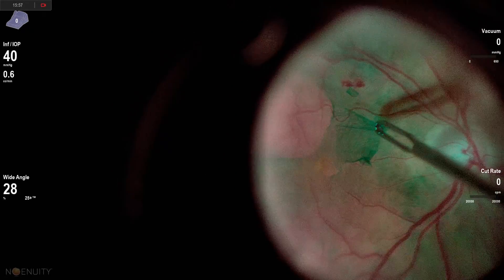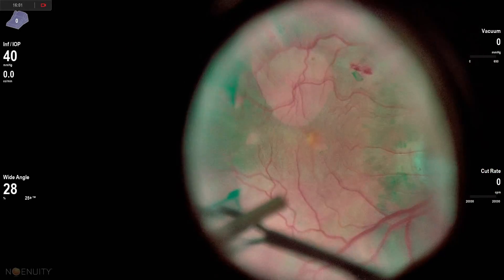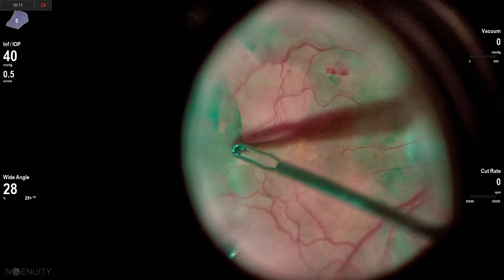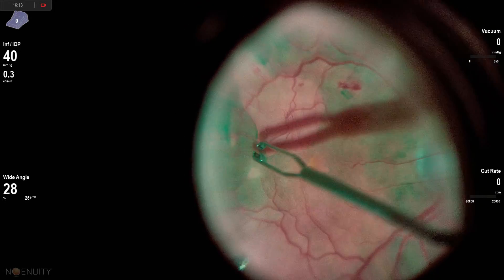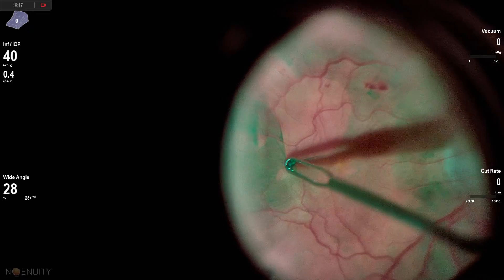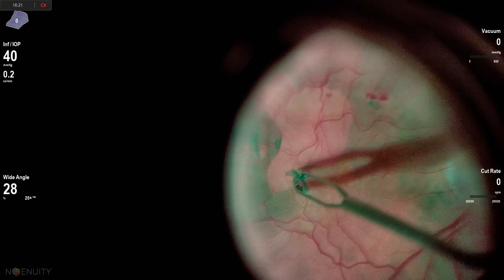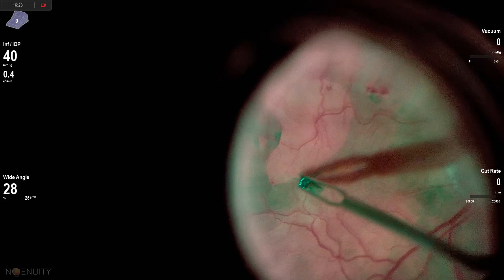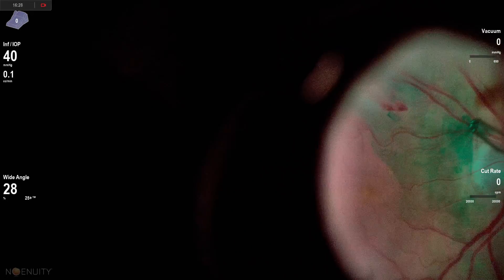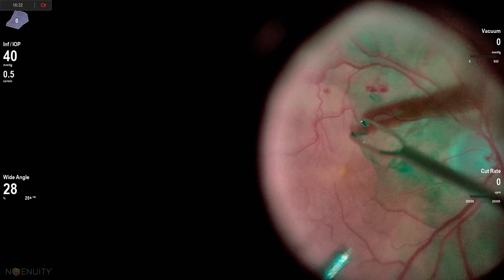It starts to peel in the wrong direction, so I'm going to try to redirect it. I can't quite get it to redirect the way I want, so I'm going to go back and grab in a different area and peel it up towards my light pipe and then around the macula. You can see here — it's this pinch and peel technique. It comes up pretty nicely but does tend to shred sometimes, so you do have to go back and re-grab.